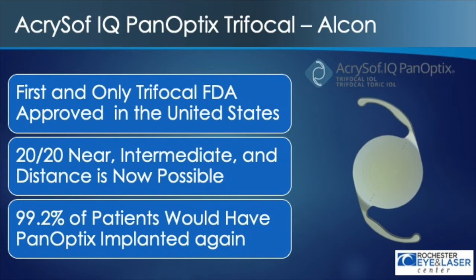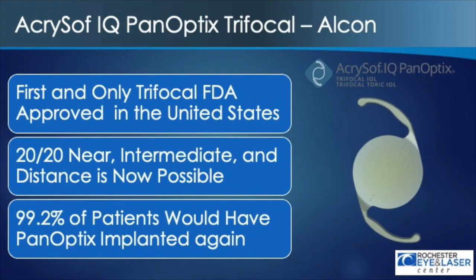Is this a hard or soft lens? These lenses inside the eye? Yeah. They're acrylic lenses and they're foldable, so that would be considered soft. They're a different material than contacts. The intraocular lenses are made of either silicone, acrylic, or a couple of other materials, but most of the ones that I use are acrylic lenses. They're foldable, and they'll go through about a 2.2 incision.